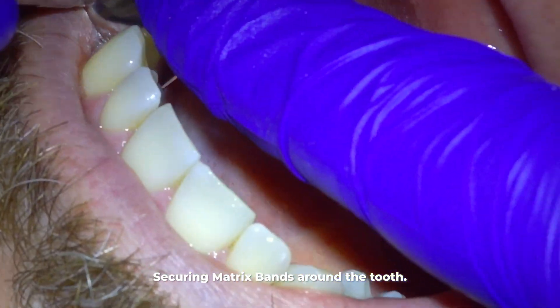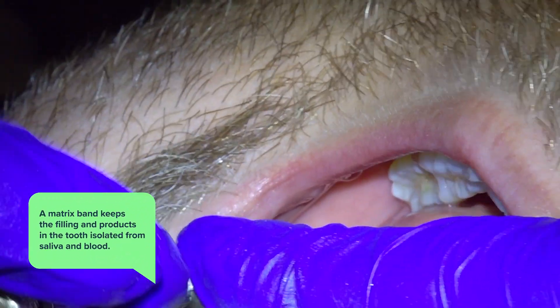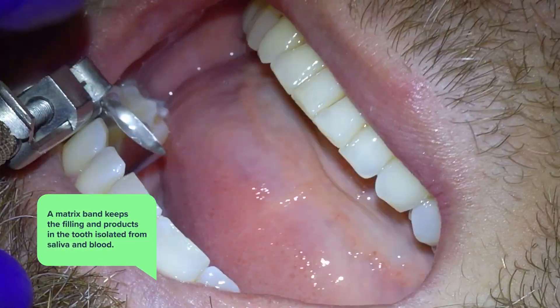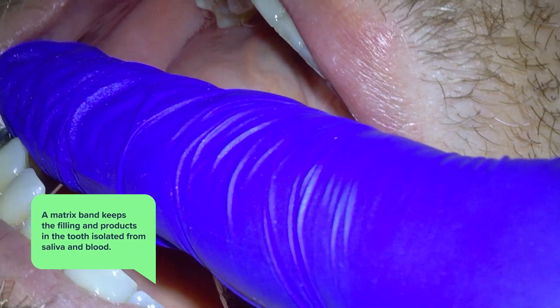We start the filling of that slot by putting on a matrix band, which will keep the filling and the products we use to fill it isolated from the saliva, blood, and the rest of the mouth.